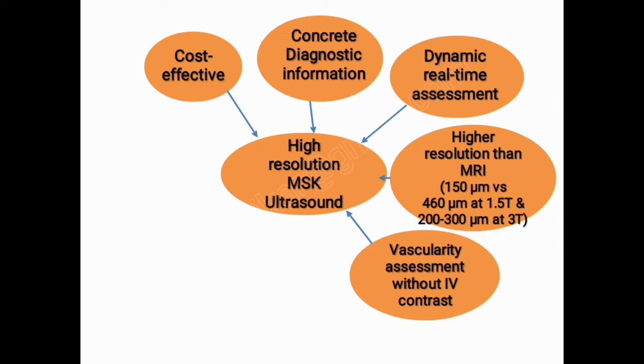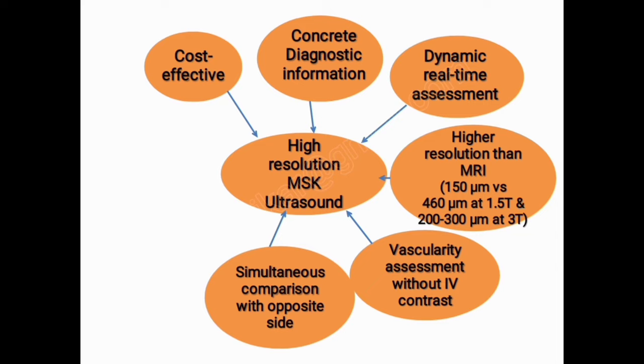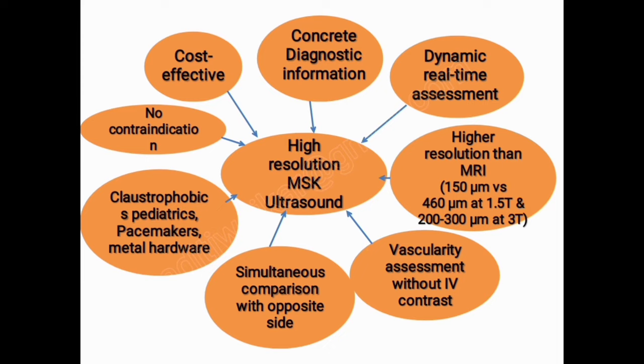It allows vascularity assessment without IV contrast. Simultaneous comparison with the opposite side is possible. There is no obvious contraindication and can be safely done in claustrophobics, pediatrics, patients with pacemakers, metallic hardwares in whom MRI is contraindicated.